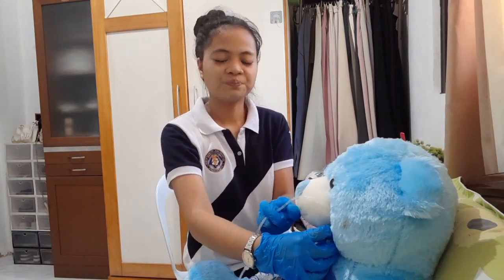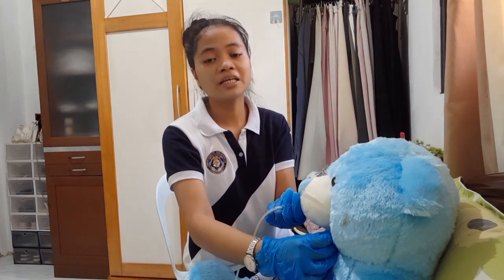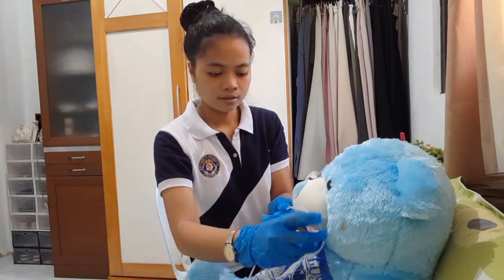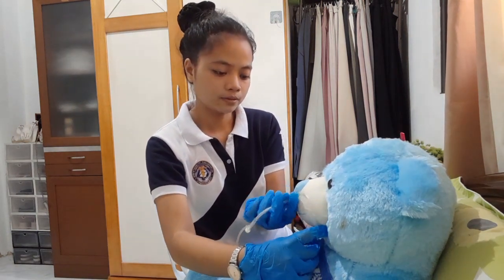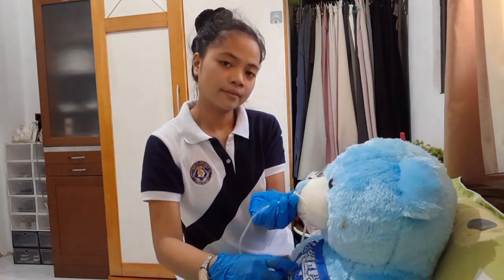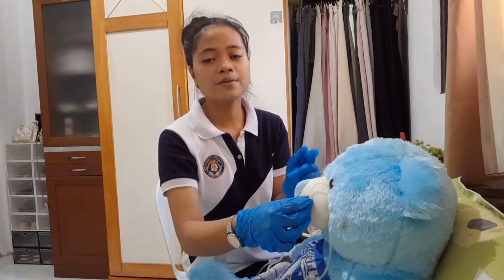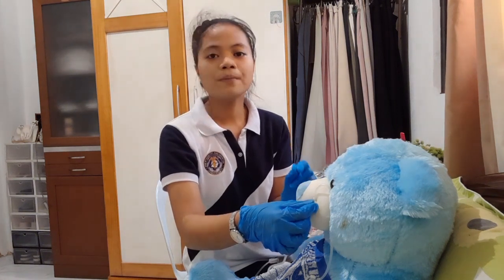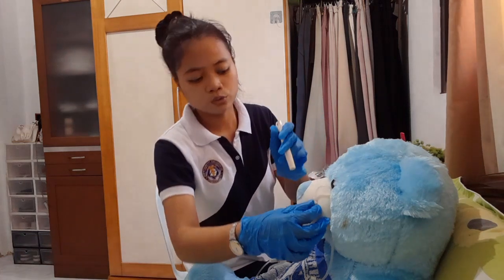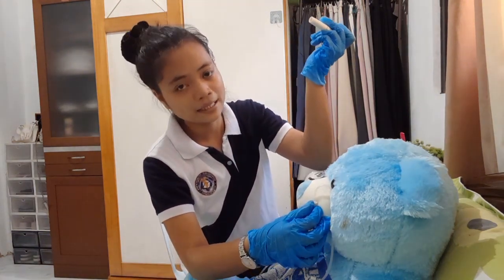Then advance the tube as far as the mark insertion point. So we're going to advance. So sige, na-advance po. So, until the mark insertion point. Then check the back of the client's throat to make sure that the tube is not curved into the throat. So, kapag hindi nakikita, we're going to use a pen light.